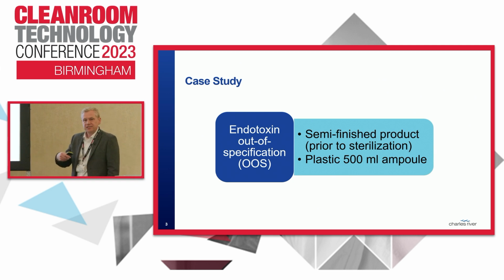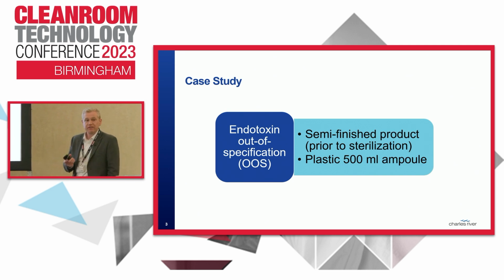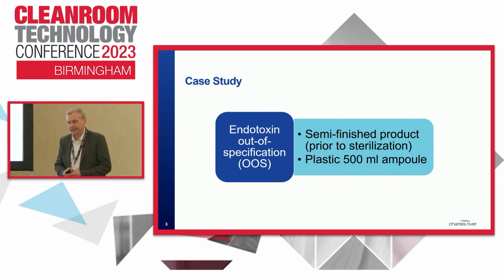The case study started with an endotoxin out of specification. It was an out of specification event in a semi-finished product, which was packaged in a plastic 500 ml ampule. As I'm sure you're all aware, endotoxins are pyrogens. Endotoxins are made of lipopolysaccharides, and lipopolysaccharides come from the cell walls of gram-negative bacteria.